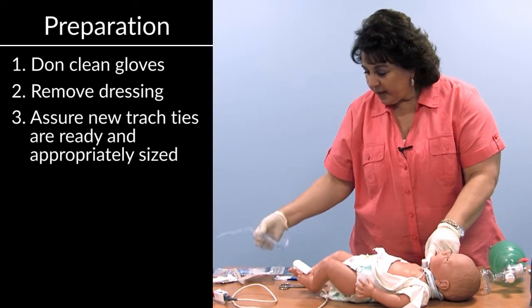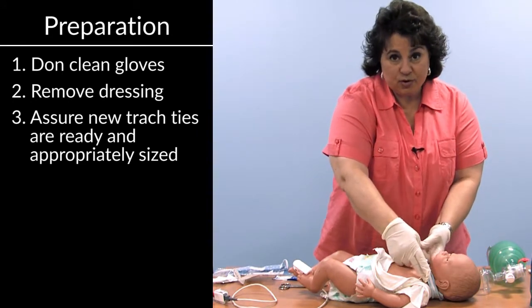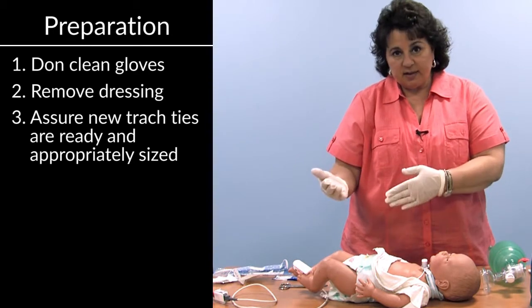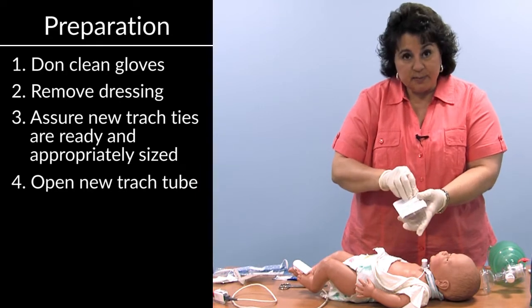You would like to prepare your trach tie in advance so you know the length. It's good to measure the distance of the trach tie that's on there so that you can pre-cut the next one for next time. I'm going to open up my tracheostomy tube.